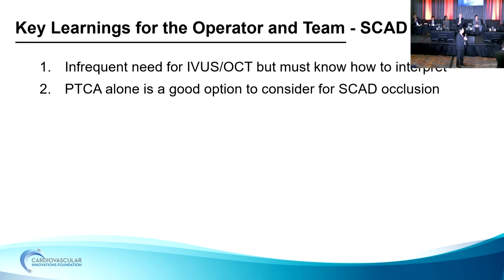One question that comes up: if a man comes in and the coronaries look like this, I know it happens, but what is your threshold, and do you do things differently in men versus women with typical angiographic appearance? Yeah, I would really question the diagnosis in a man. Question and question and question again. And they're the ones I would go further and further to try and solidify the diagnosis.